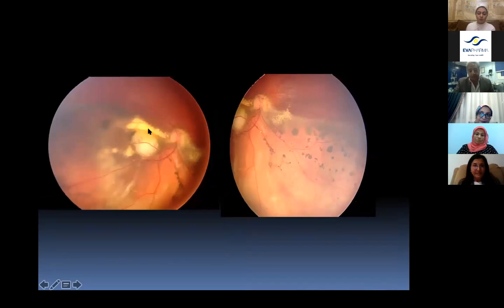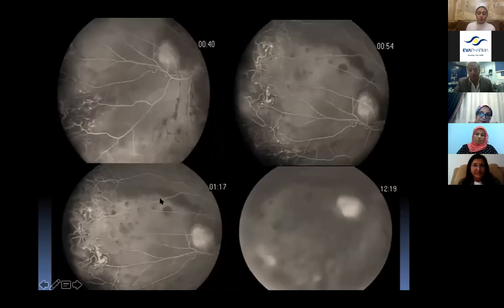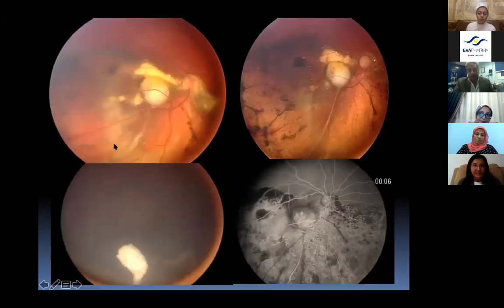the detachment, exudative in nature, and looking at the fluorescein angiography, we can see the capillary non-perfusion along with telangiectasia. Again, telangiectasia is the dilatation, and then regression, and then the constriction, and then the dilatation of the vessels, as you can see on different grades of fluorescein angiography flow. Because of the high exudation in the retina and the excess fluid, we kind of thought about the telangiectasia.